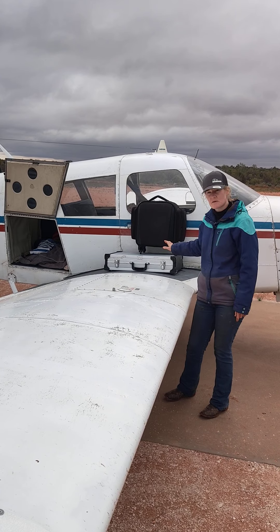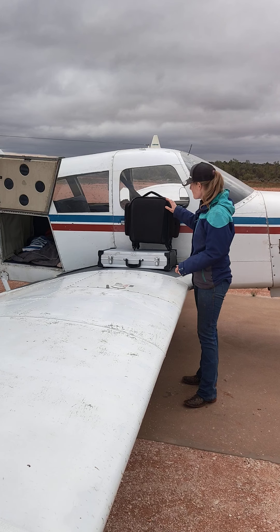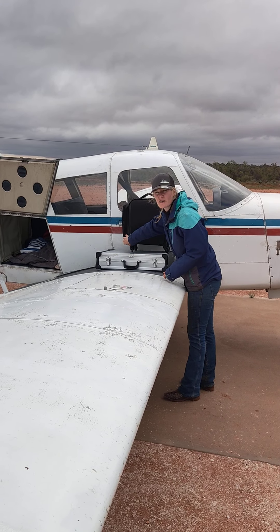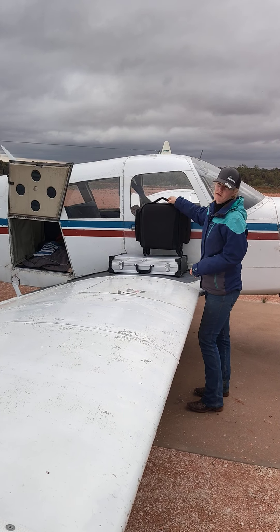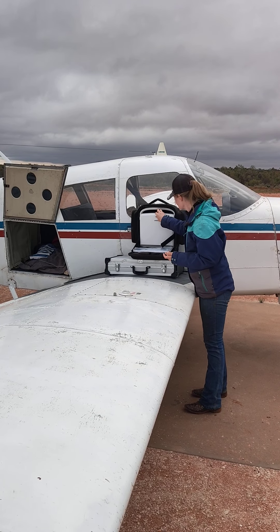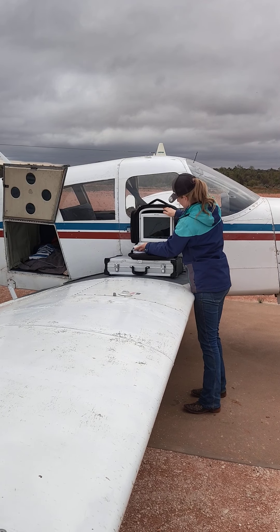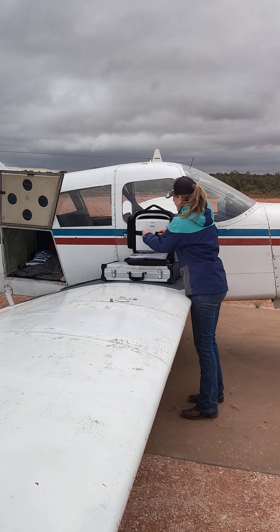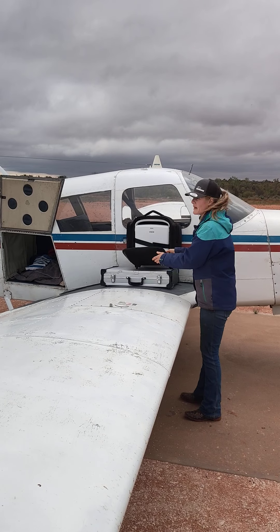I also have some new equipment that I'm really excited to share with you all. I recently purchased an ultrasound with a mare scanner, so I can do mare reproduction work, cattle reproduction work, and also small animal ultrasound scanning. And it's fully portable — that's my beautiful little ultrasound there in a beautiful little wheelie bag. So that means I can do any ultrasound on just about any animal, on just about any area.